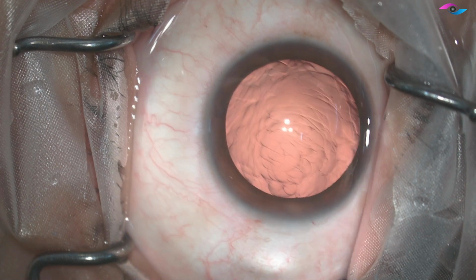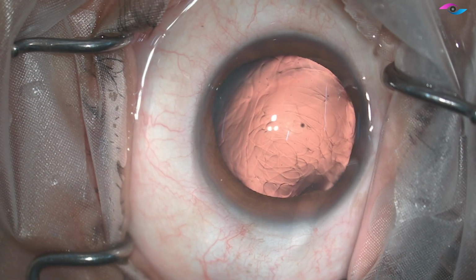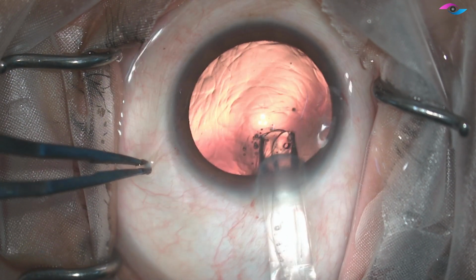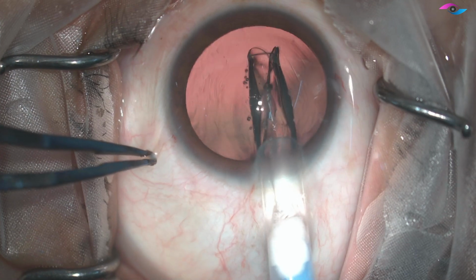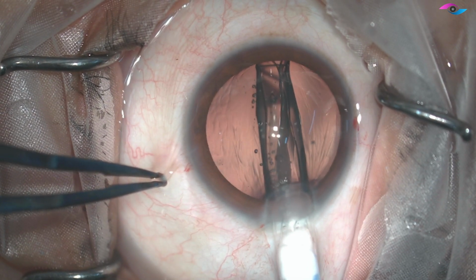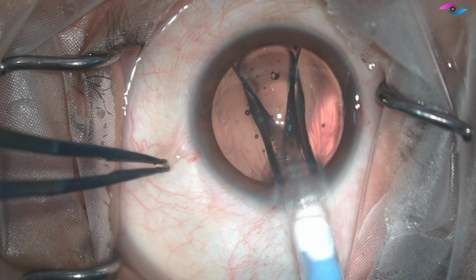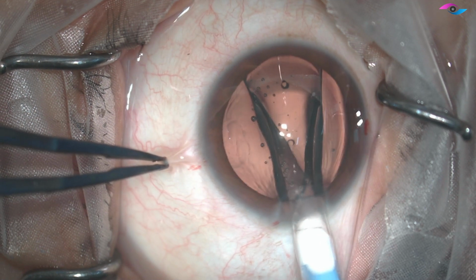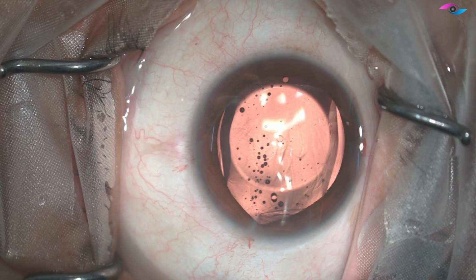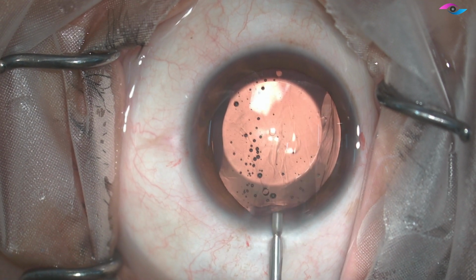And next comes the step of implanting the ICL. Here it is important to implant the lens slowly, carefully, looking at how it's opening up inside the eye. What we are looking for is that the hole in the haptic should be at the right leading edge, and that means that the vault is correct and that the ICL has opened up in the correct position. If the ICL is flipped, then we need to remove this lens and reload it.